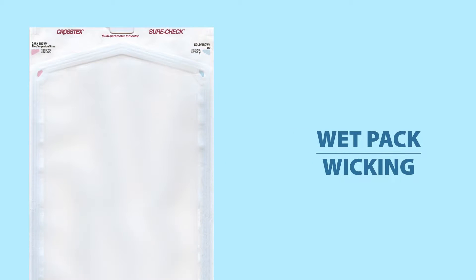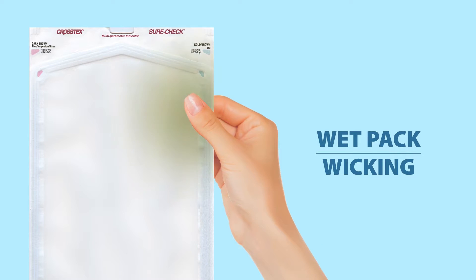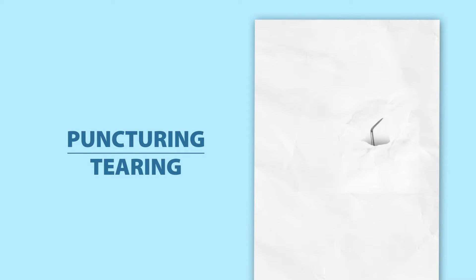It's important that our packs or pouches be totally dry before we touch them to remove them from the sterilizer, because there's a phenomenon known as wet pack or wicking which can result in a transfer of bacteria from the hands to the pouch. There's also a chance of puncturing or tearing when the paper is still wet.